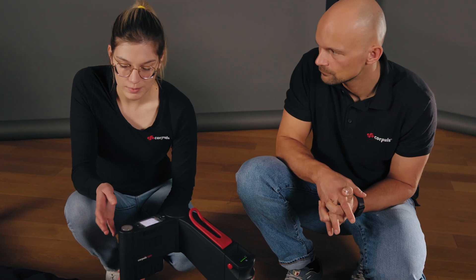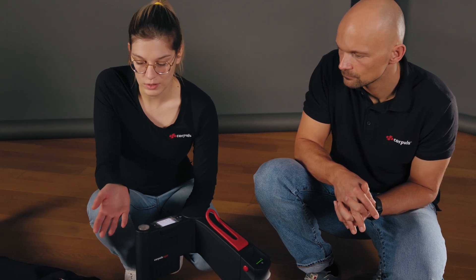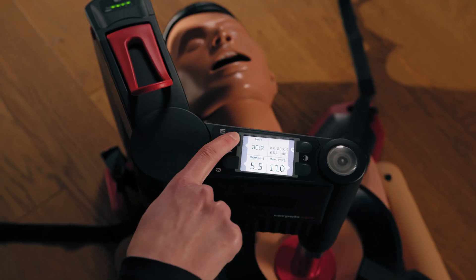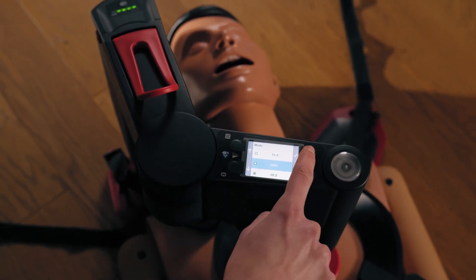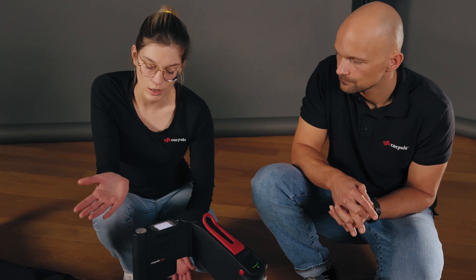What usually happens is that you start a resuscitation under standard conditions in 30:2 mode. During the course of the resuscitation the airway is secured, and you want to change the mode to continuous. To do so, press the corresponding soft key next to the mode, select from the list, confirm this, and either go back using the back button or, if you don't press anything, it automatically jumps back after three seconds.